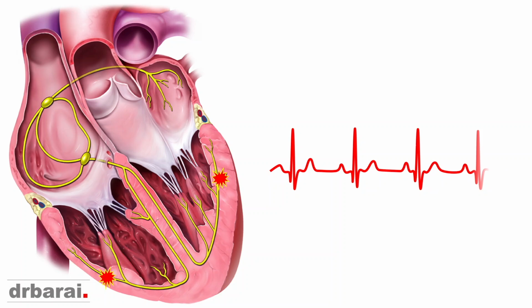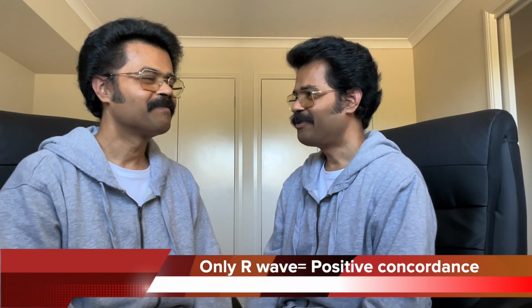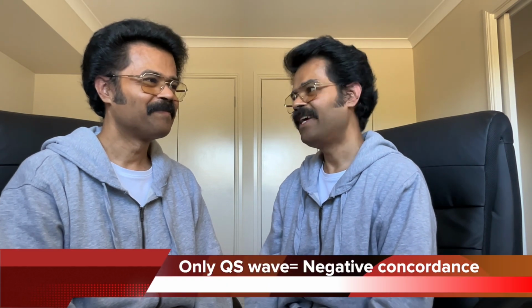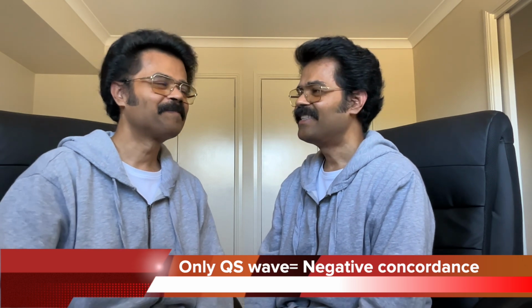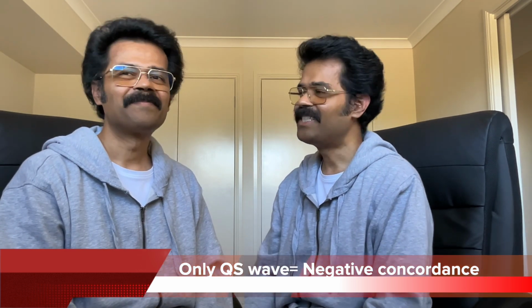Normally, you will see an R wave and an S wave, a positive wave and a negative wave. If you don't see that pattern, if you see only an R wave, which is a positive concordance, or if you see only a negative wave, which can be a Q wave or S wave, that is a negative concordance, and if the QRS complex is wide, this is highly likely to be a VT rather than SVT.